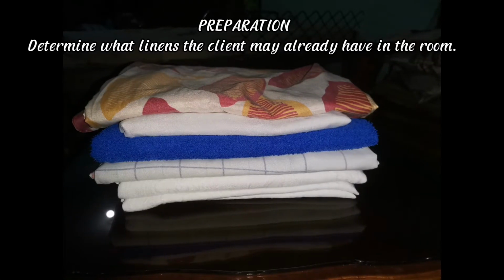The purposes of making an unoccupied bed are: first, to be ready for the next occupant or patient. Second, to prepare the bed for the client's return. Third, to provide a clean and safe environment for the patient. And lastly, to minimize the source of infection and skin irritation. For the preparation, determine what linens the client may already have in the room.